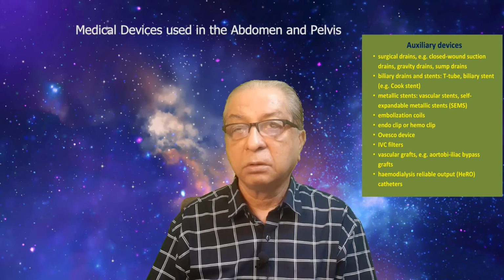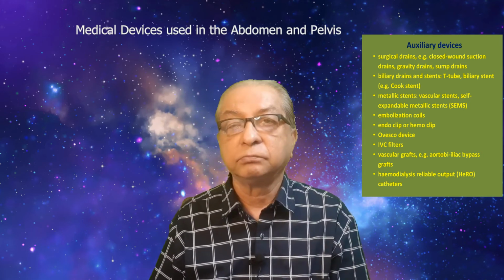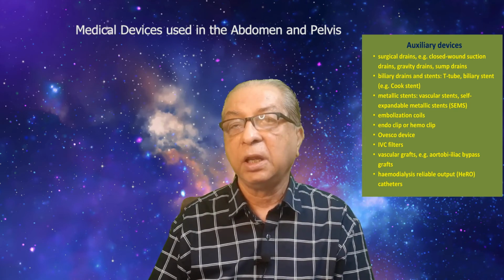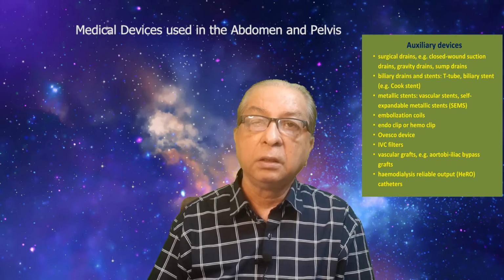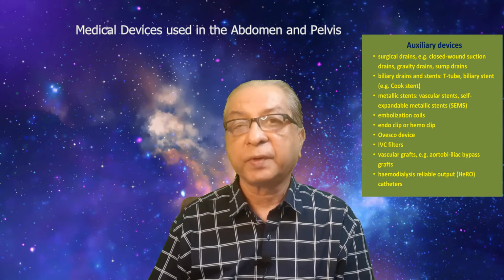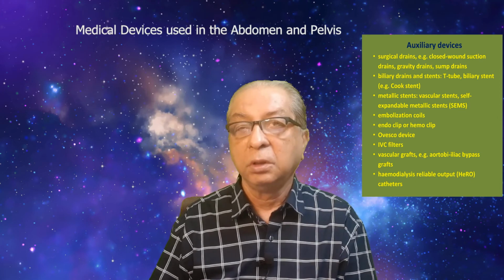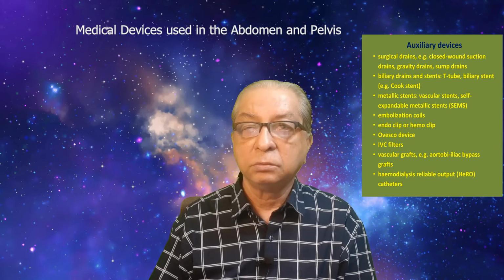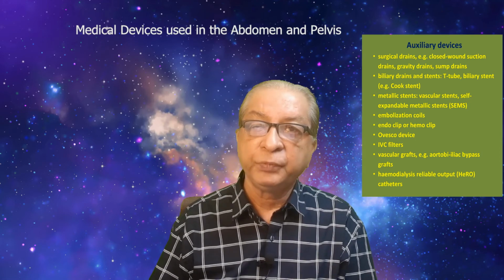There is cancer of various organs or areas in the abdomen and urogenital area. As part of cancer treatment, radiotherapy beads, points or pellets could be implanted for some duration. So do not meddle with those implants yourself.